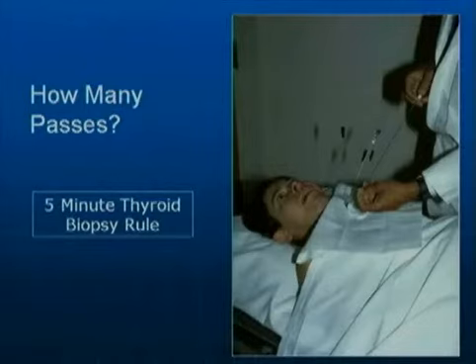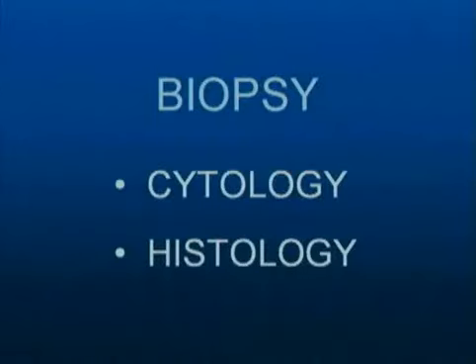We'll stop. My old plan of attack was I would do 2 biopsies. I would stop. I had a cytopathology tech there. I would ask him, is my specimen adequate? I always got the same answer back. Yes, it's pretty good, doctor, but we would like more. And after number 3, guess what the answer would be? We liked more. So finally, I learned after doing many of these, I'd do 4 or 5 within a 4 to 5 minute time and then stop after that time.